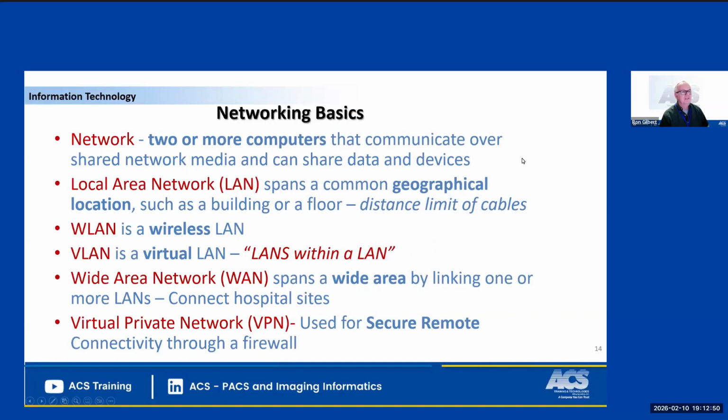First, you know networks, two computers communicating over the network. That's exactly what it is. You have to remember what makes one not talk to the other or neither of them talk. And that's when you start to figure out things. But most of the time, networking is set and forget. Once you get it going, get it running, then you have to look at what changed. Otherwise, if you don't change anything, it should stay running as long as you want it to.